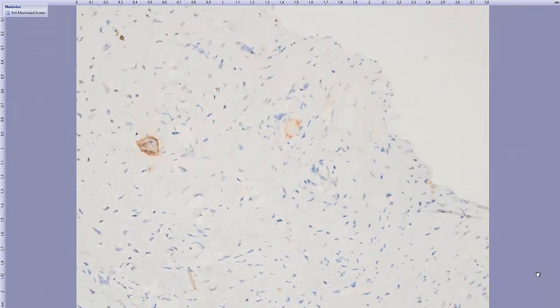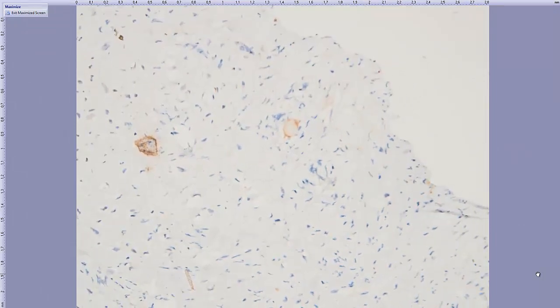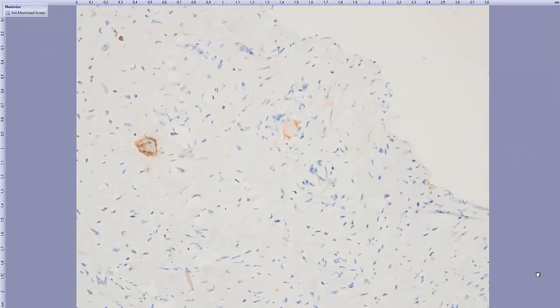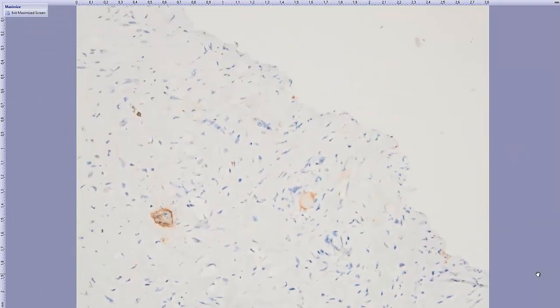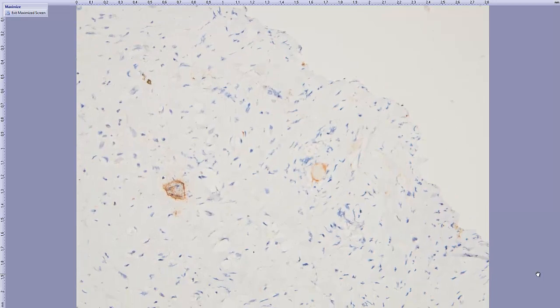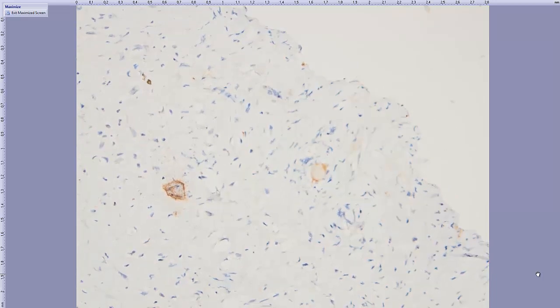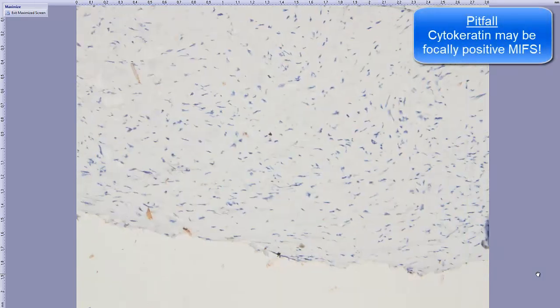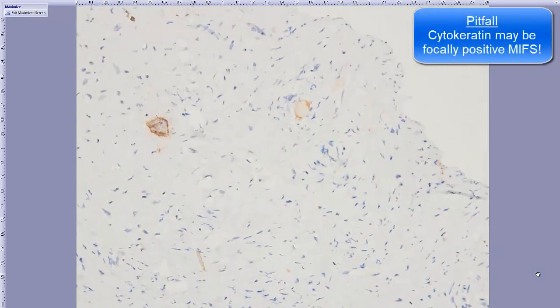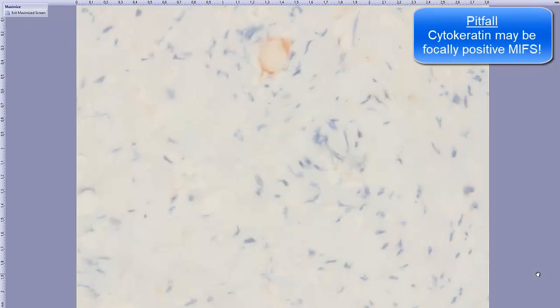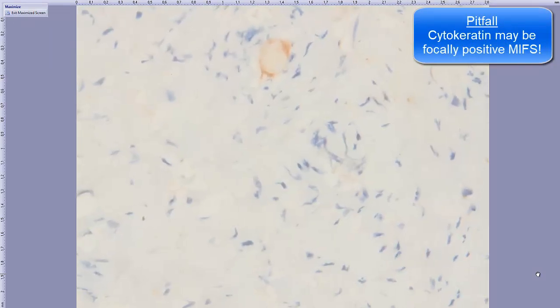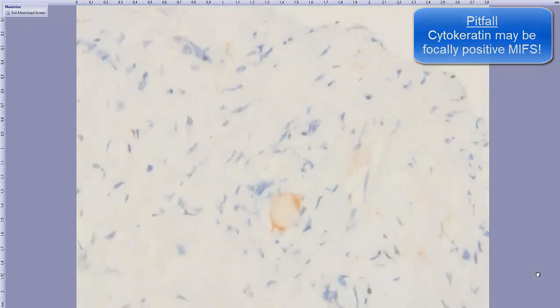Cytokeratin is an important issue because cytokeratin may also be focally positive in myxoinflammatory fibroblastic sarcoma. This is a cell with positivity.